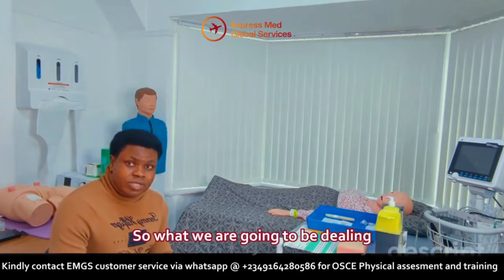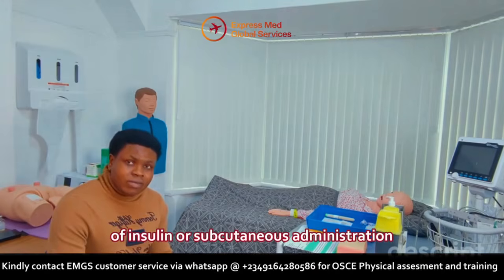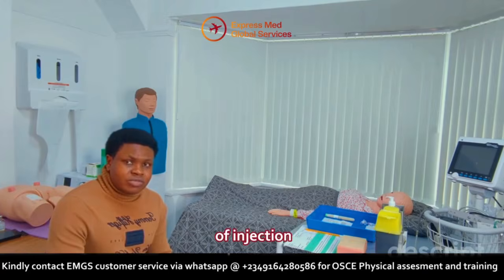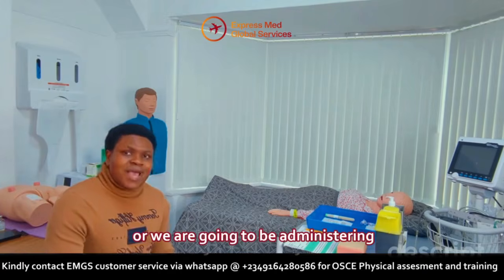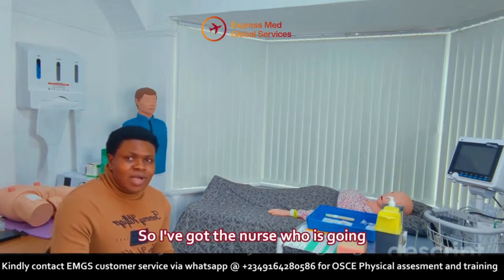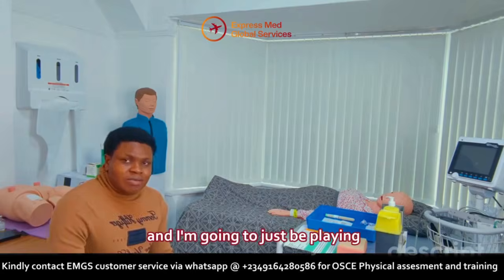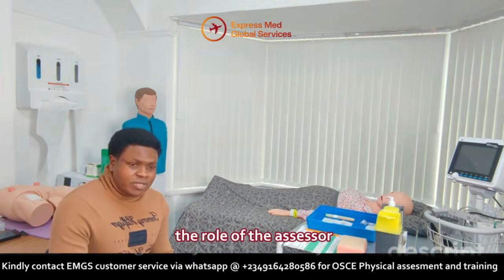So what we are going to be dealing with today is administration of insulin, or subcutaneous administration of injection, or we are going to be administering injection subcutaneously. So I've got the nurse who is going to be performing this procedure, and I'm going to just be playing the role of the assessor.